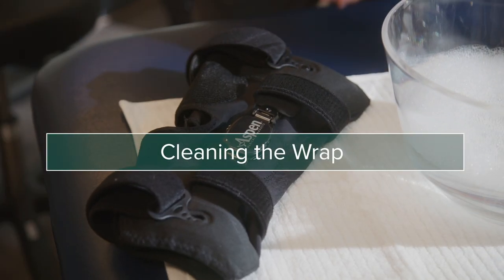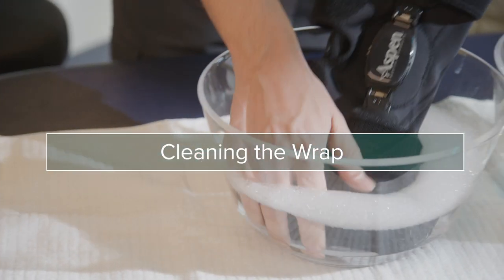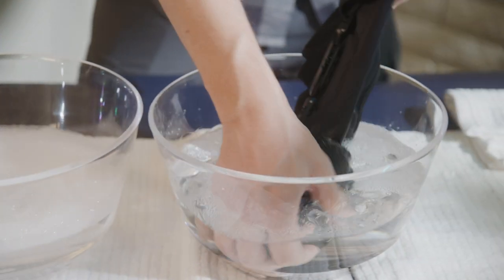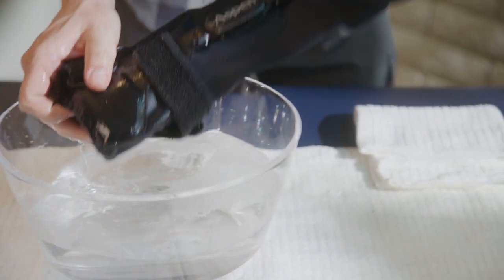The Aspen OA Knee Wrap can be hand-washed and air-dried. Wash with mild soap and water, rinse thoroughly, and allow to fully air-dry.